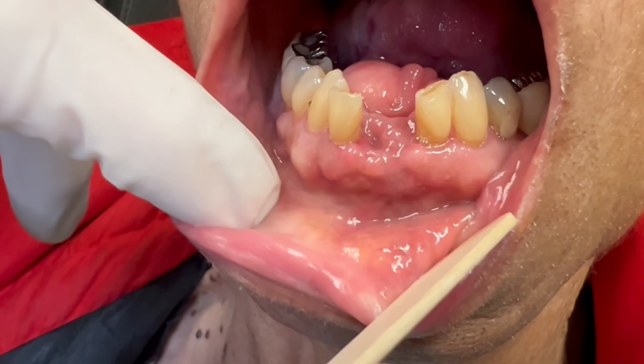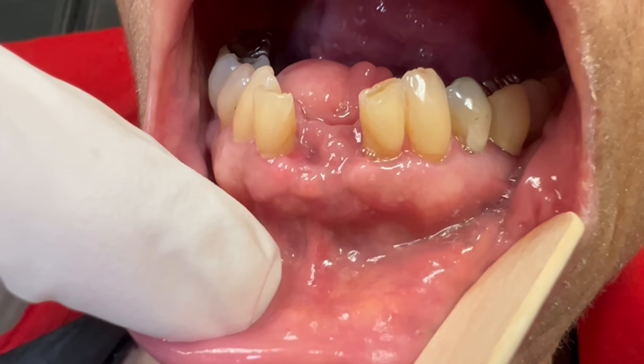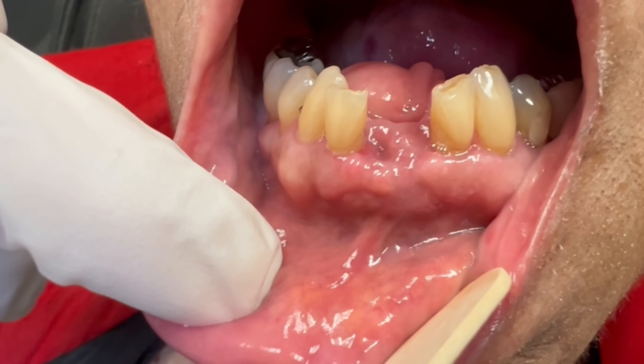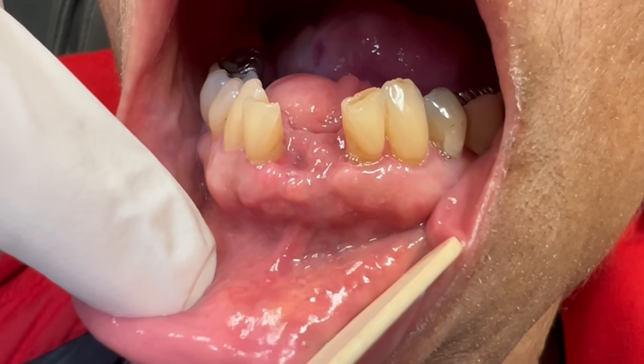The infection is more likely to clear without any foreign material in the area and she'll still be very happy with the end result. The patient was prescribed antibiotics and I saw her back one week later and three weeks later to ensure appropriate healing. Here is the site three weeks out from the procedure. We can see it is healing well and there's no sign of a persistent infection. She's very happy and she's now out of pain.